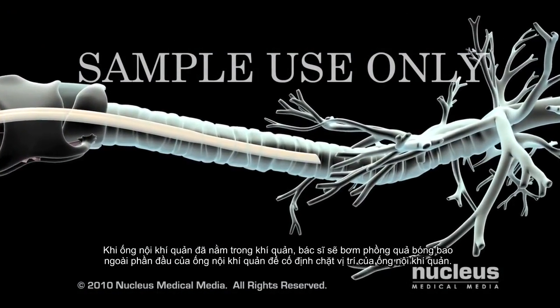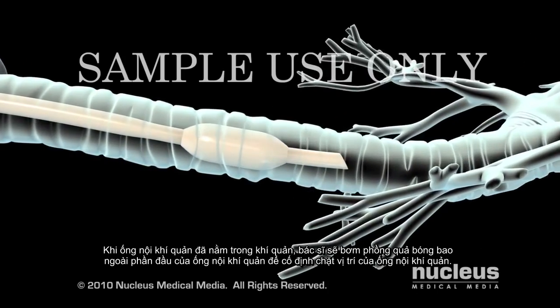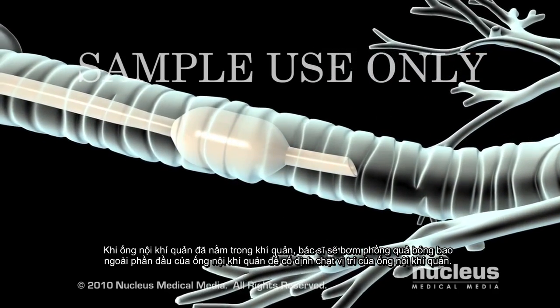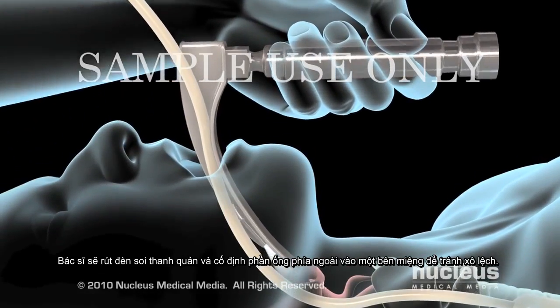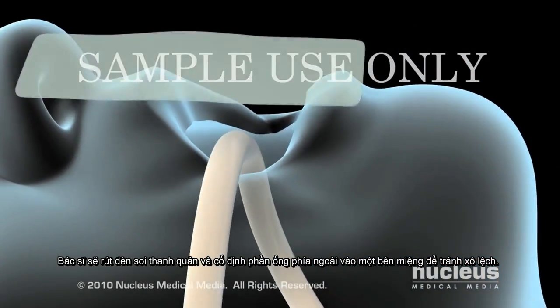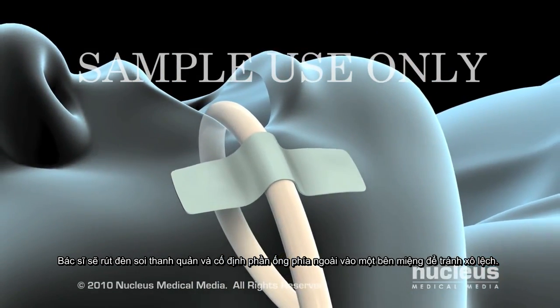Once the endotracheal tube is in the trachea, your doctor will inflate a small balloon surrounding the tube to make sure it remains snugly in place. Your doctor will remove the laryngoscope and tape the tube to the corner of your mouth to prevent it from being jostled out of position.